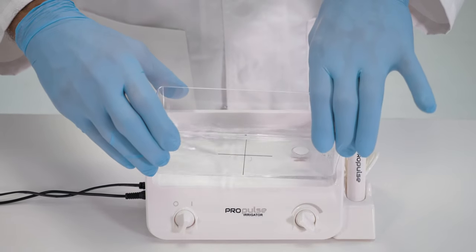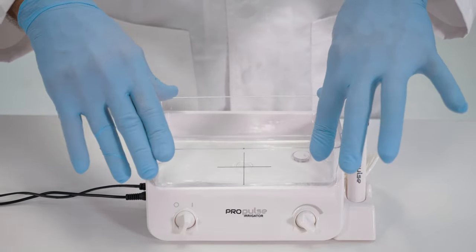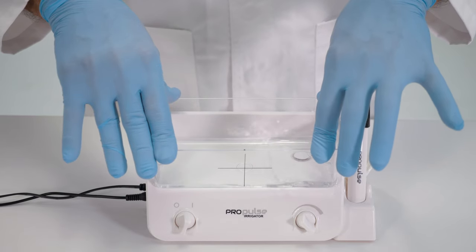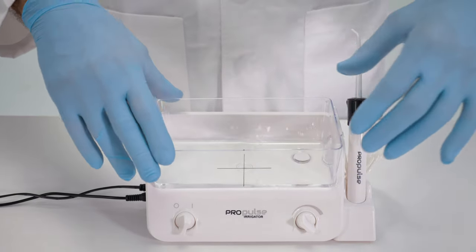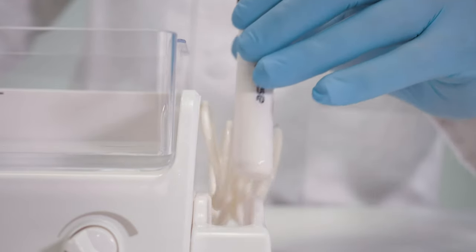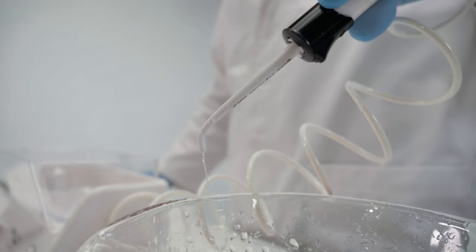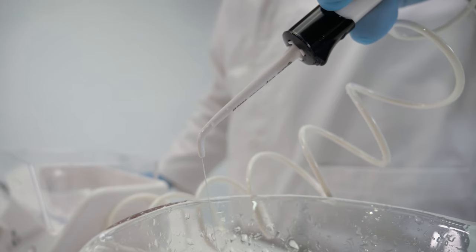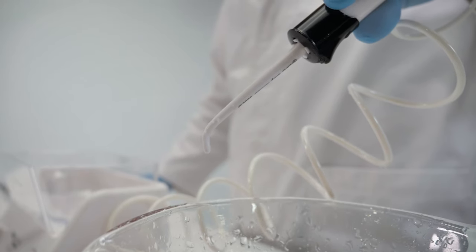To finish the rinsing process, add approximately 100 millilitres of clean warm water into the reservoir. Then, firmly press the reservoir into place. Turn the machine on and ensure that all the decontamination solution is washed from the irrigator by rinsing it through and discarding.